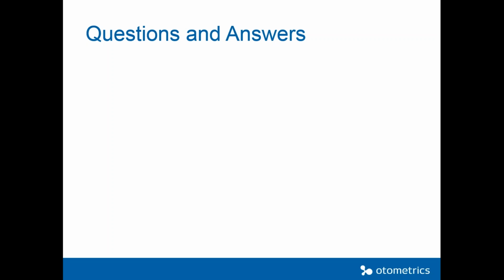We have the Chartr, yes. And I don't know the details about the Chartr system. But the Chartr is more diagnostic. Yeah, it's a diagnostic. And the rate you can change and actually use a different kind of rate. But I think it's very important to point out here that we have some devices that are for screening, and we just have a pass and refer, and other devices that are for doing diagnostics. Absolutely. And what we are talking about here is more about the screening device.